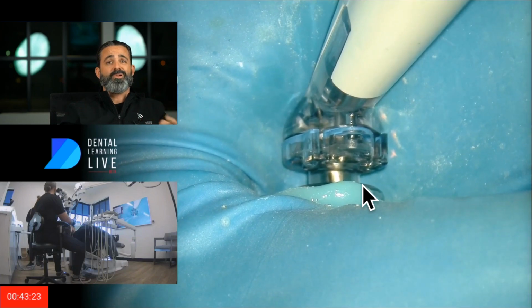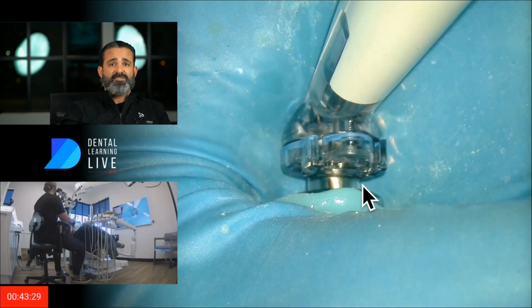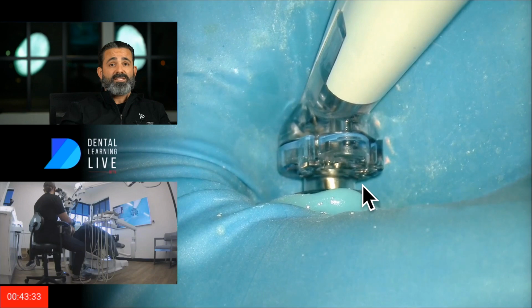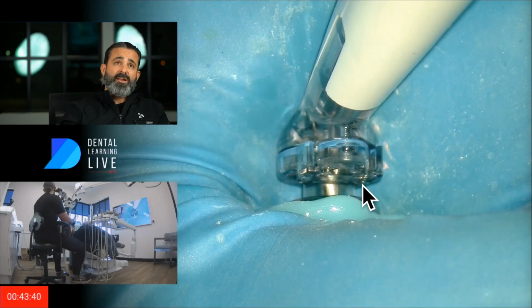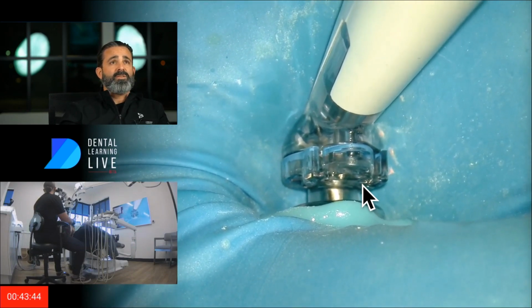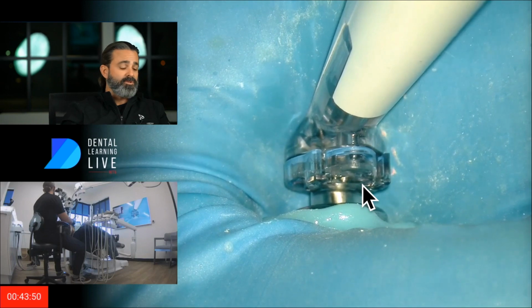Now, I want to employ that at the terminus, clearly, because there weren't any signs of coronal leakage and there weren't any signs of bad endo, or iatrogenic endo, I should say. And I didn't see any smelly muck coming out of that. It was just gutta percha and solvent cleaning out. And so now it's very important that these theories, these fluid dynamics and these principles are applied at the terminus of the tooth.